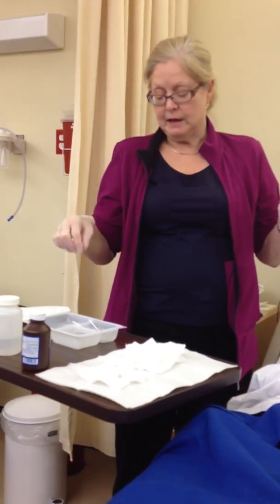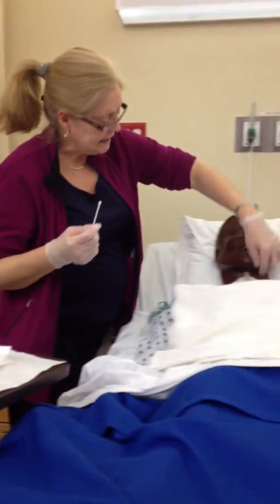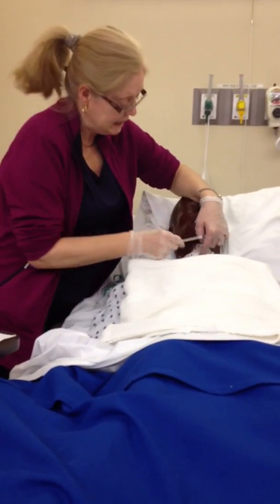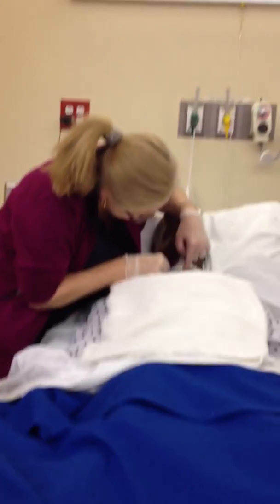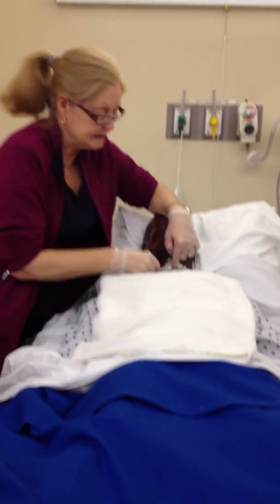Okay, so now I'm going to take my swab here, and here's the thing, guys. When you're cleaning the trach, some people have a very short neck, so it's not easy. I don't want you to put this on the outer skin. You need to get up here where the actual opening is, the wound opening, because that's what we're cleaning.